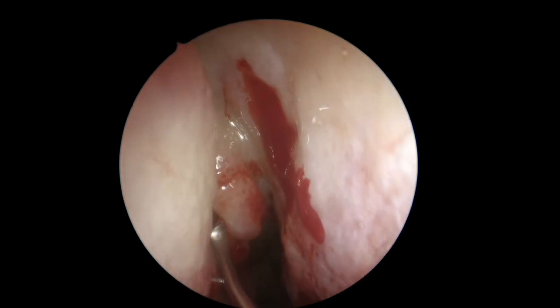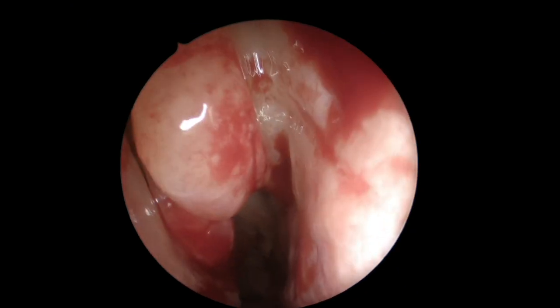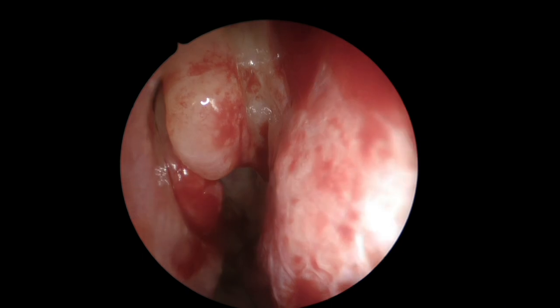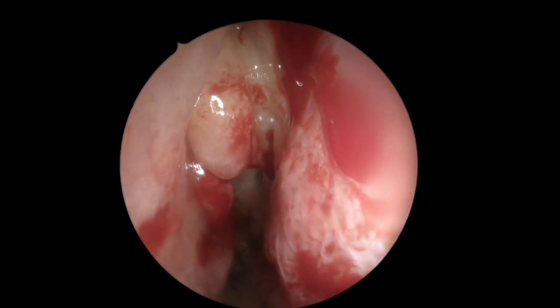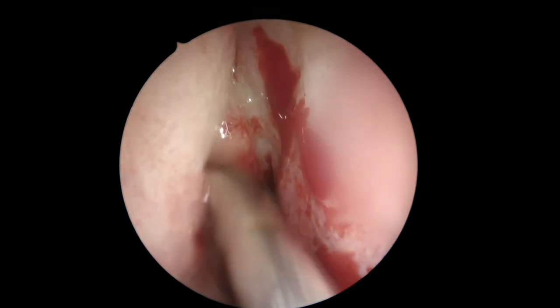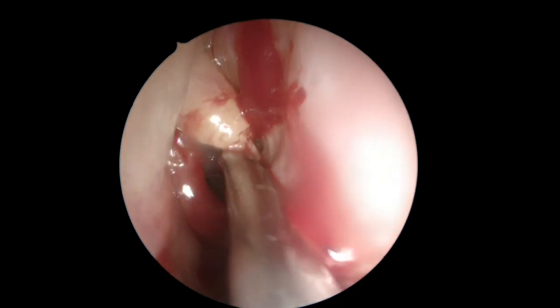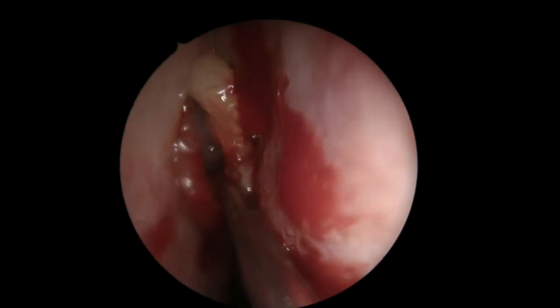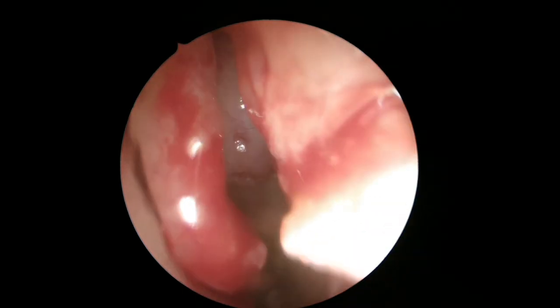So it bleeds less and we can show a better understanding of the anatomy. We're exploring now and we can see that the patient has a very prominent uncinate process. Just below this big uncinate process you can see the bulla — it's a little bit hidden — just behind the uncinate process, where we're going to find the bulla.